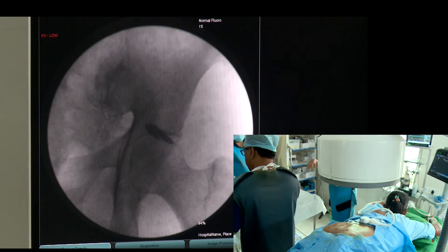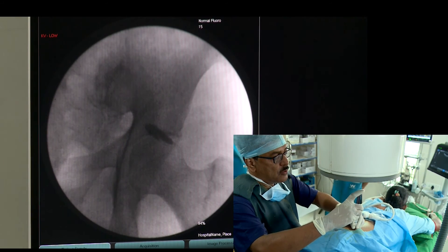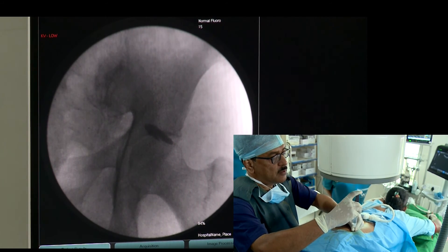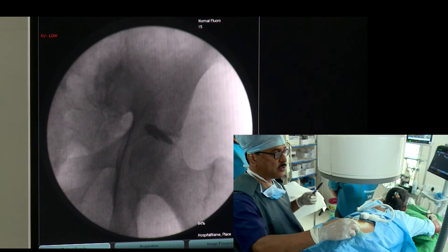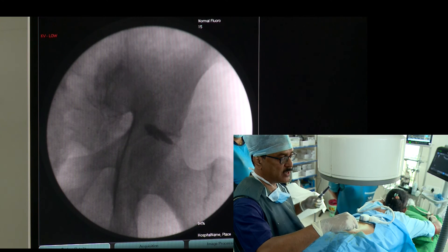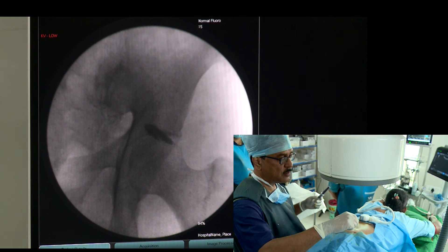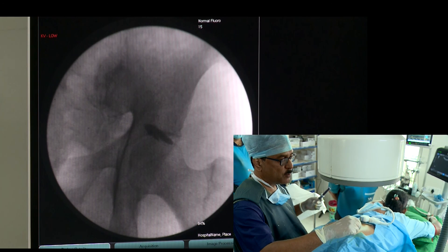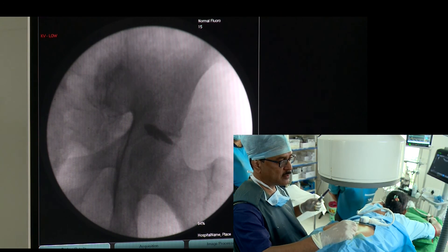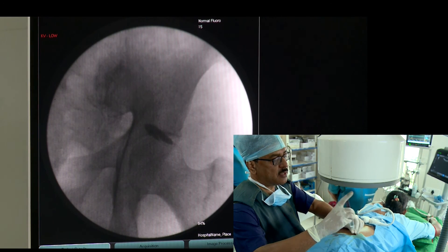Now I will be giving local anesthetic. What I can do again — as I was doing on the other side — is make a little bit of puncture. You can see this is called the jump sign; the muscle will be jumping and contracting. And a little bit of local anesthetic, and that's all. Thank you.